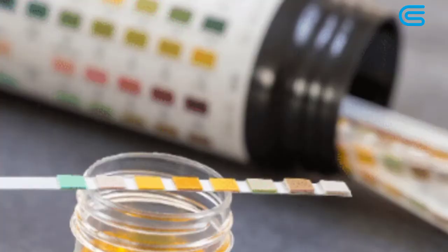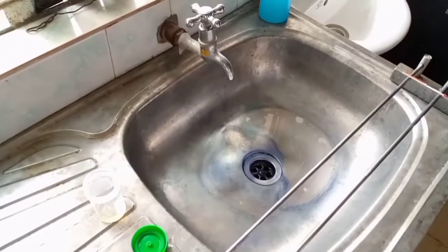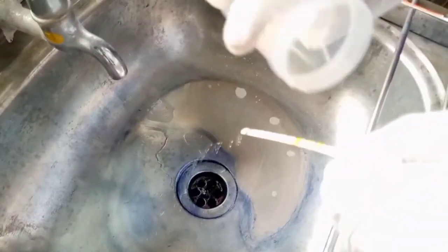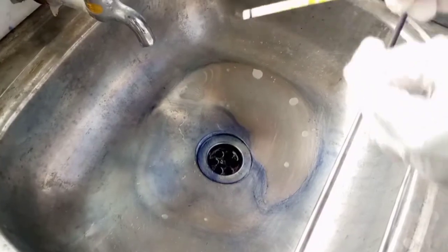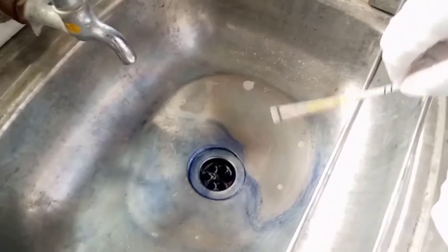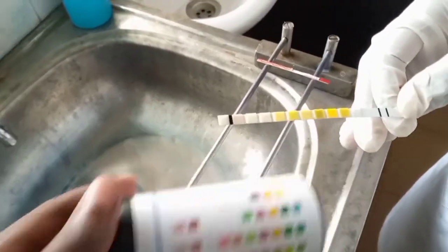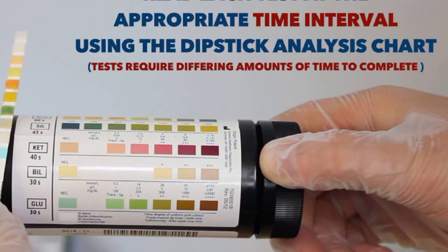The urine dipstick is a narrow plastic strip which has several squares of different colors attached to it. Each small square represents a component of the test used to interpret urinalysis. The entire strip is dipped inside urine, and the color change in each square is noted. The color change takes place within 2 minutes. That's so fast for dipping in the strip. If you read the strip too early or too long after it has been dipped in the urine, the results may not be very accurate.